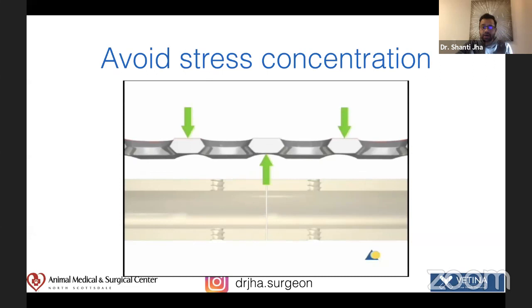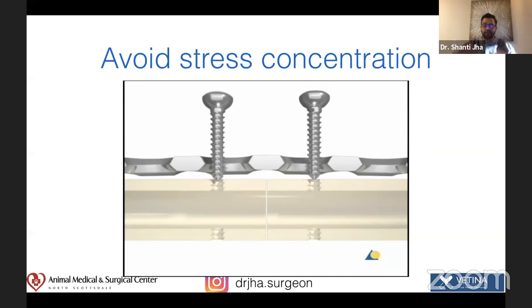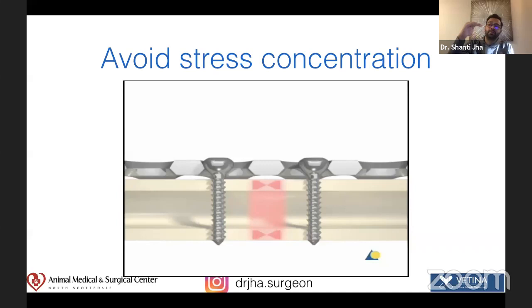plate. See how I'm pre-stressing the plate, as I was showing in the video, where I twist or turn the plate like that. And when you do that, since there's a gap between plate and bone at the cis cortex, as you tighten the screws, it will pull the trans cortex up and then it will oppose it properly.